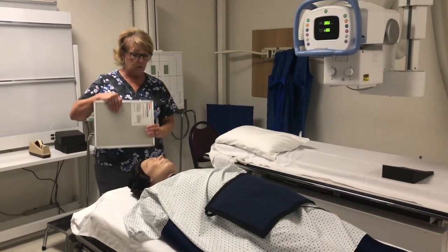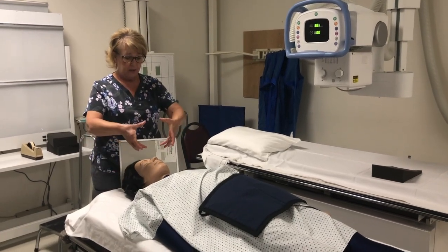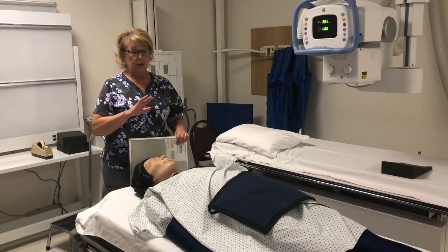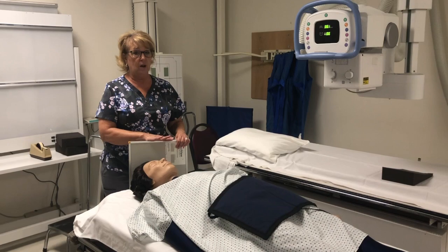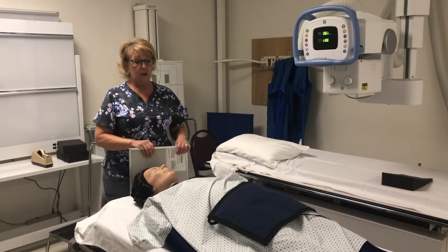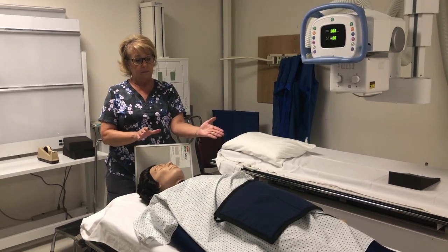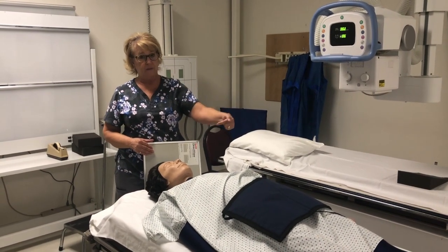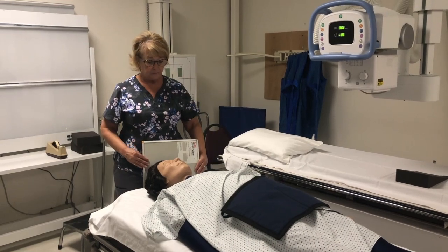And so what you would do, again, the neck diameter is not much bigger around than a knee. We don't necessarily have to use a grid, and in this instance we would not, because we're going to be putting in a double tube angulation. So not only are we coming in 45 degrees rather than having the patient be 45 degrees, we also have to put in a 15 to 20 cephalic angle to open the foramina.